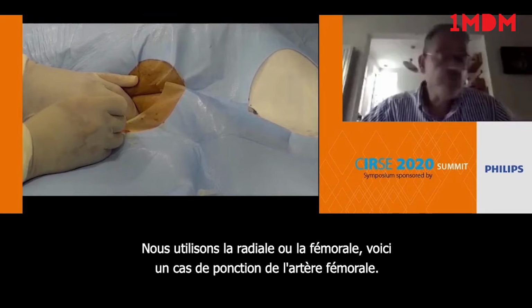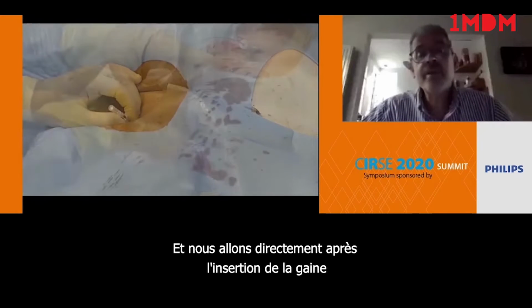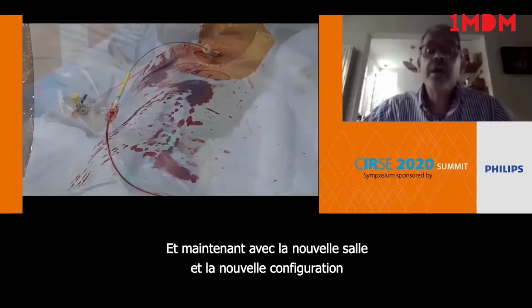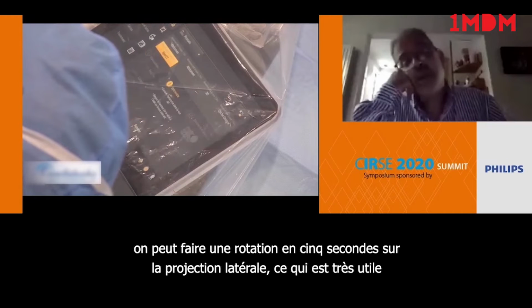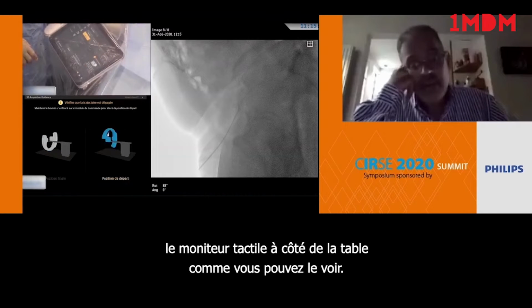We use radial or femoral. Here is a case of femoral artery puncture. And after insertion of the sheath, we would directly go for global cone beam at the aortic bifurcation. And now with the new room and the new setup, we can do a rotation in 5 seconds on the lateral projection, which is very useful. And I can pilot everything from the table, the side table monitor, as you can see.